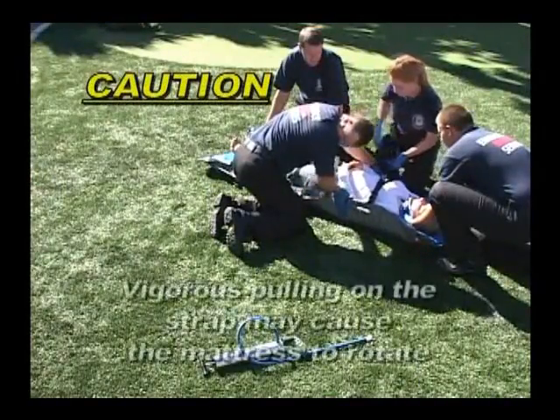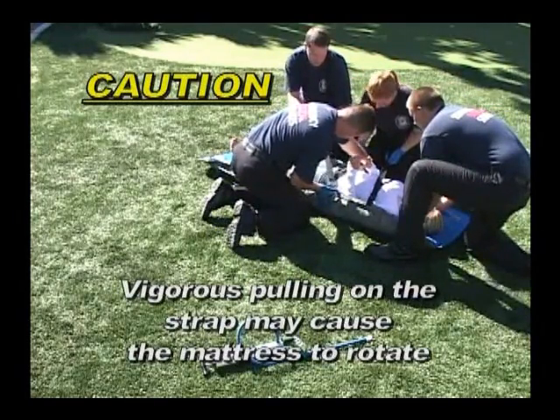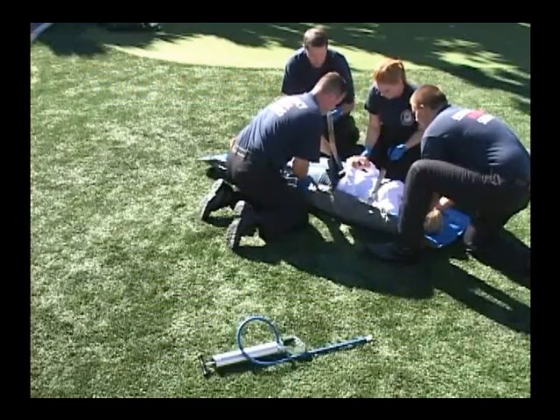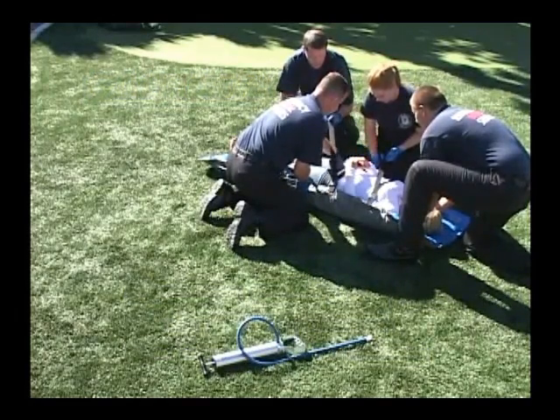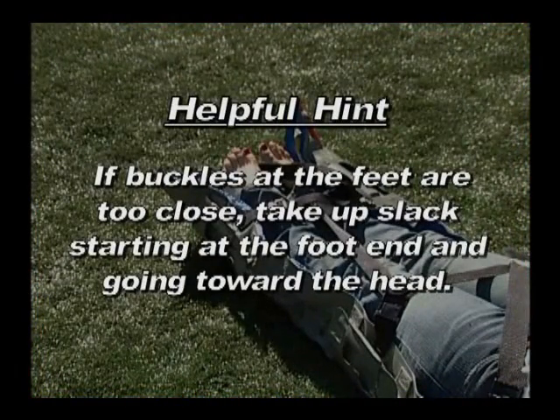CAUTION: Vigorous pulling on the strap may cause the patient and/or the mattress to rotate. This can be avoided by always feeding the strap through the buckles while you tighten the strap. Note: you may find it helpful to store your vacuum mattress with all the buckles attached, and then unfasten only the buckles on the side of the mattress that will be slid under the patient. This should make it easier and faster to apply the mattress. If the buckles at the foot end are very close together, it may be easier to remove any excess slack by tightening the strap in the reverse direction, moving from the foot end toward the head end of the patient.